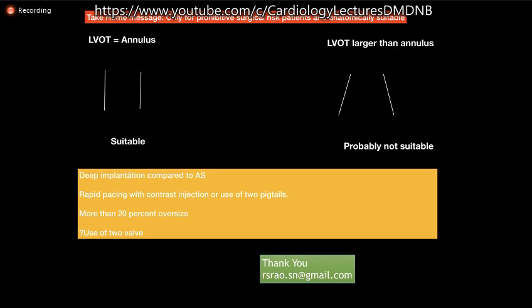TAVR for AR is only offered for prohibitive risk patients, and the CT scan anatomy should be suitable. In my own opinion, if the LVOT is equal to the size of the annulus and the valve is around 20% oversized, such an anatomy is suitable and TAVI can be attempted.